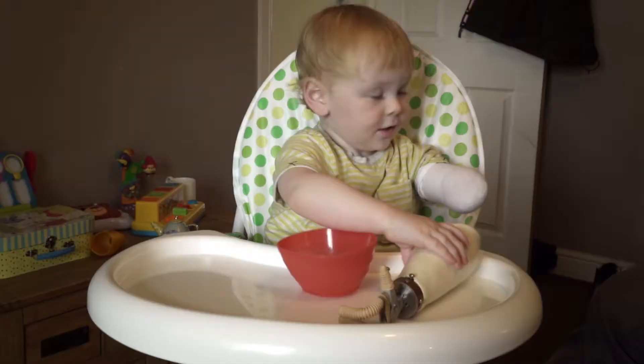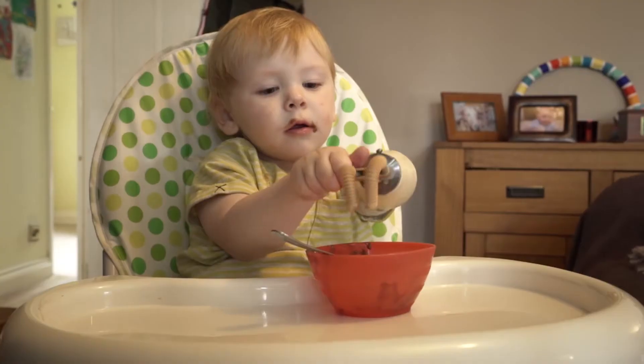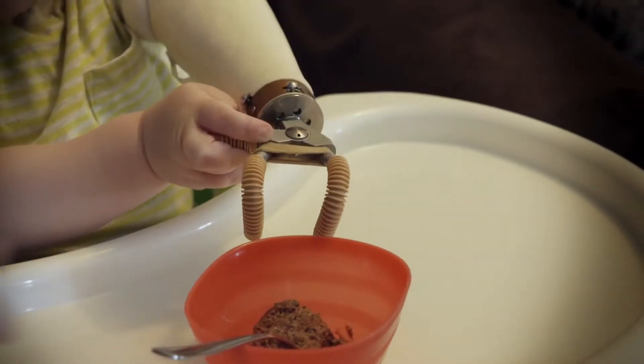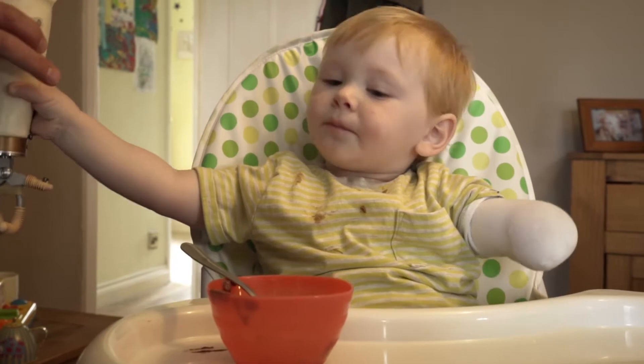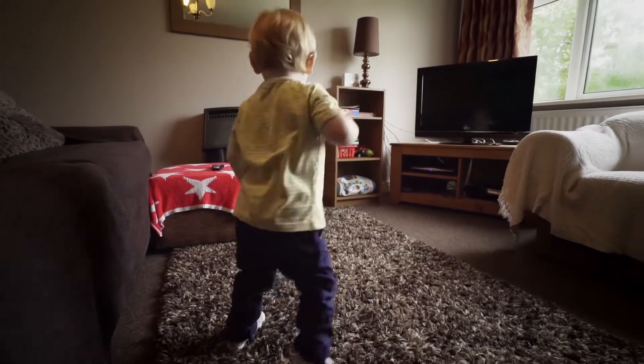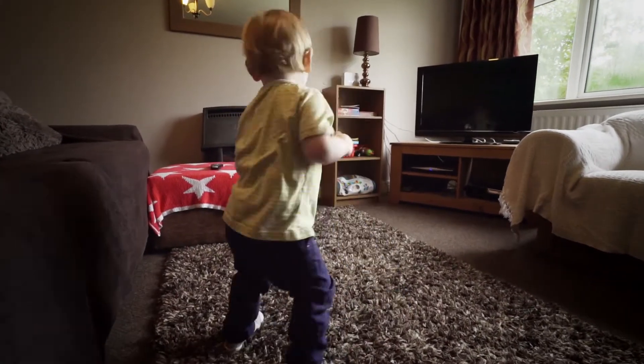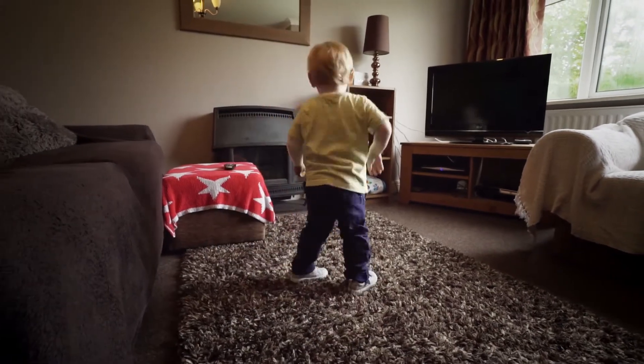The biggest challenge for Sol was to be able to accept a grabbing artificial arm when it would finally be given to him at the age of three. I'd seen lots of stuff about kids rejecting prosthetics because it had been left too late, and that just spurred me on to try and do something myself.